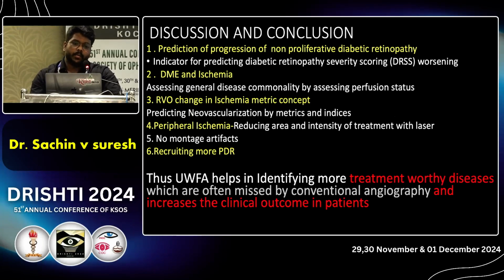It's an indicator for predicting diabetic retinopathy severity worsening. Thus, it predicts the progression of non-proliferative diabetic retinopathy, and it also assesses the general disease severity by assessing perfusion status, and helps in detecting diabetic macular edema and ischemic areas.